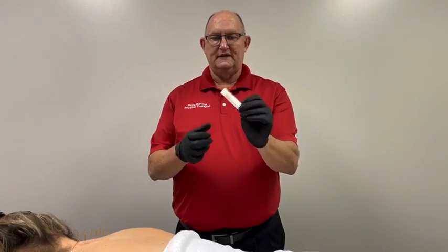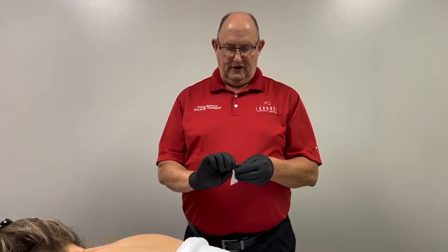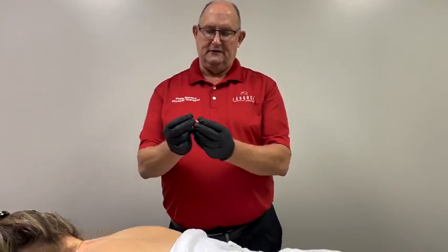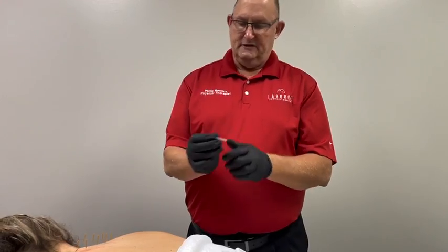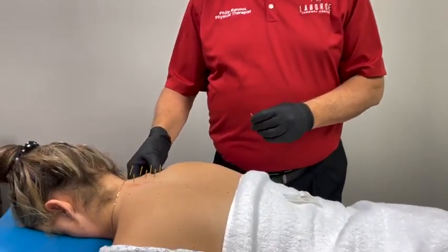What a trigger point dry needling needle looks like, it's an acupuncture needle like this. They're sterilized, they're in individual compartments, and what the therapist will do, he'll take one out and it's all sealed up, and all the patient's going to feel is the actual straw or the guide for the needle. So I'm going to stick this in her upper trap on the right. Usually that's where you have a good trigger point.